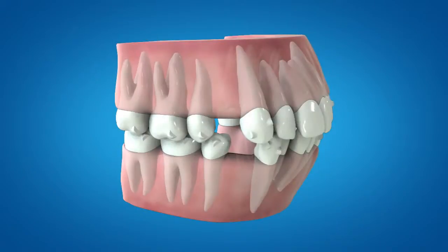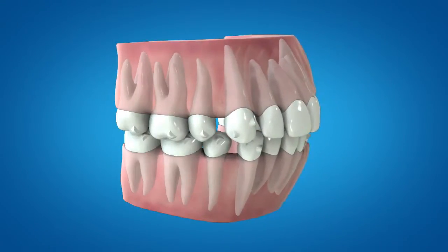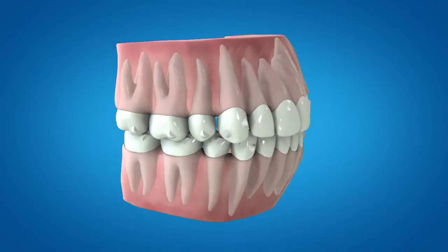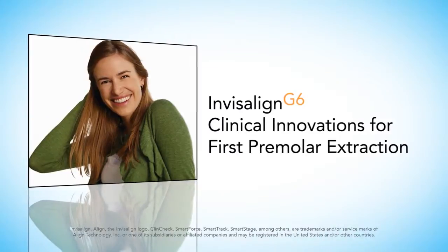Invisalign G6 clinical innovations for first premolar extraction with maximum anchorage — the next generation of Invisalign treatment engineered to help you improve clinical outcomes for your extraction patients. Discover the difference with the Invisalign G6 first premolar extraction solution.